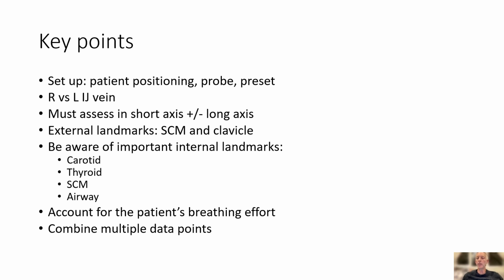Next, take note of the patient's breathing effort. This can significantly impact the form of the IJ. Finally, do not rely heavily on a single data point. The assessment of the IJ must be carefully integrated into the rest of the clinical exam, including other PoCUS information.